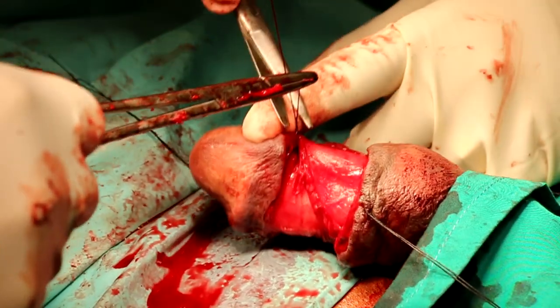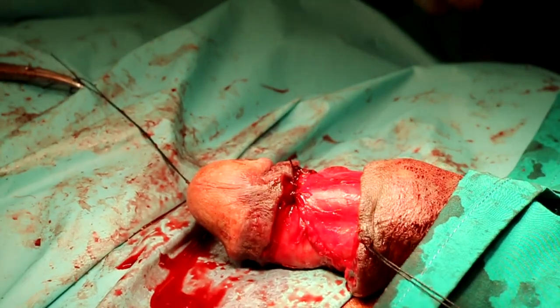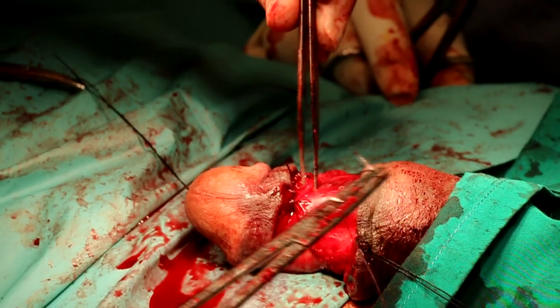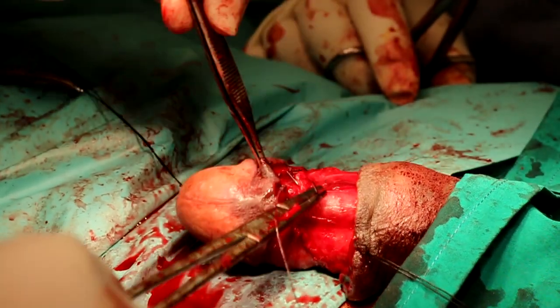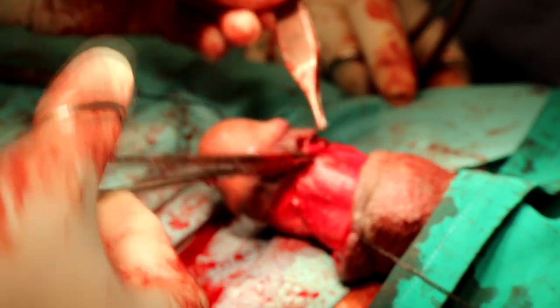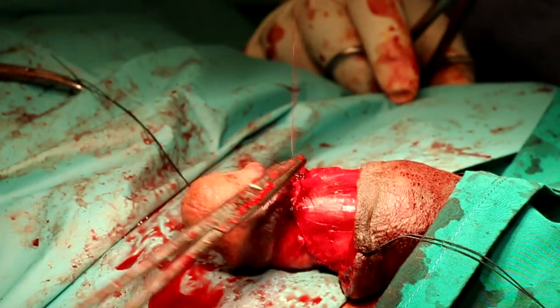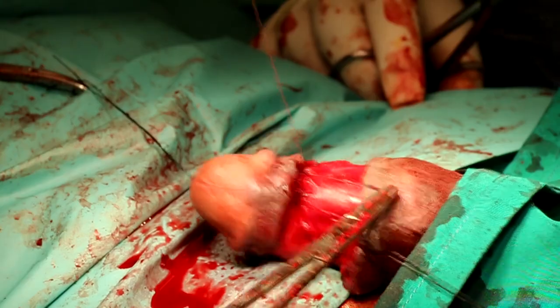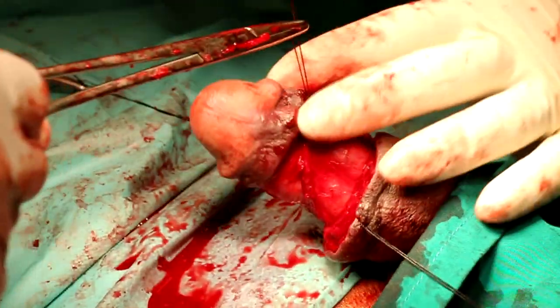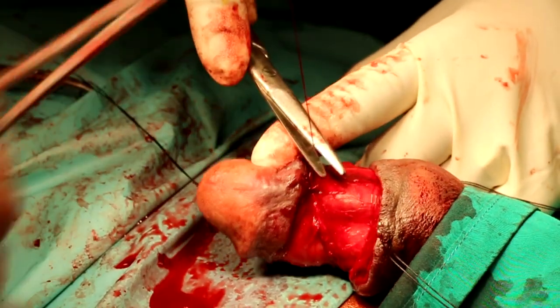If there is bleeding from the urethra, there is an indication for an ascending urethrogram. As I said, it's not common. It varies in the literature from 3 to 20%, but there is agreement in most of the published data on about 9 to 10% incidence of urethral injury. If you find any urethral injury, it can be repaired at the same time. See, now I'm almost done closing the fascia, approximating the fascia on both penile surfaces. This should be done with absorbable suture for sure.